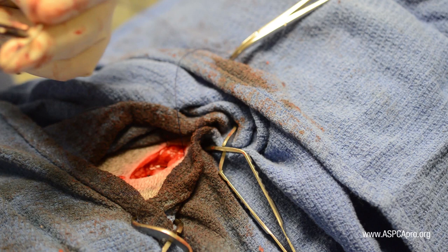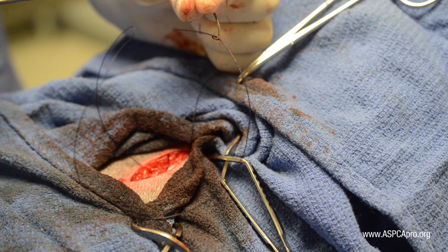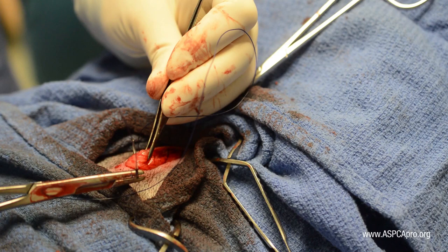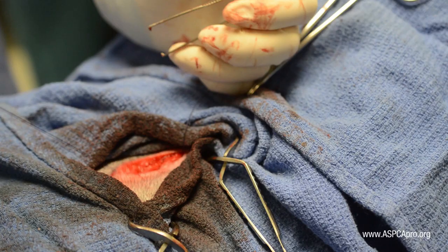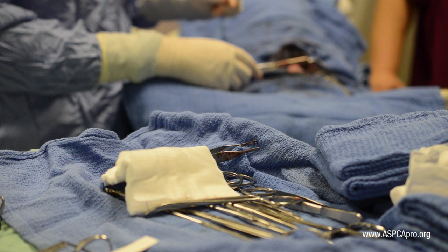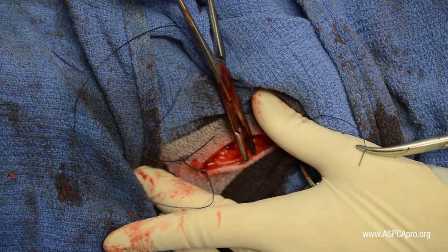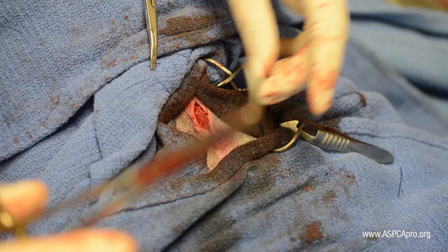Continue to close the subcutaneous tissue using a simple continuous pattern. Once the caudal end of the incision has been reached, a subcuticular pattern is then performed in the opposite direction. We recommend avoiding the use of forceps to hold the skin during the subcuticular pattern, since fingers can better be used to provide adequate tension on the skin without adding undue trauma. The subcuticular pattern is then continued cranially.